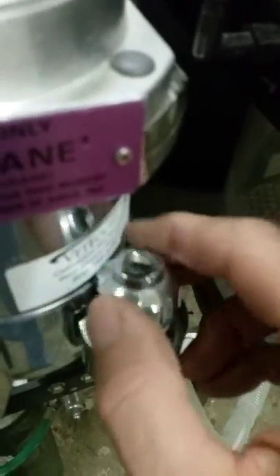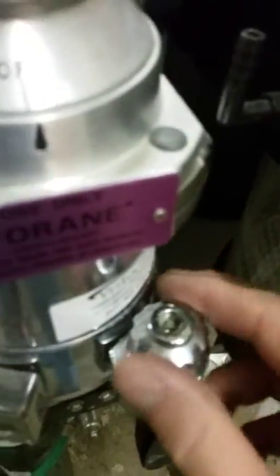The way to fill the isoflurane tank is by undoing this little metal stopper and then pouring the isoflurane straight into the container. The isoflurane is kept up here in that jar, and in these boxes there are more jars. Keep these tightly closed when not in use.